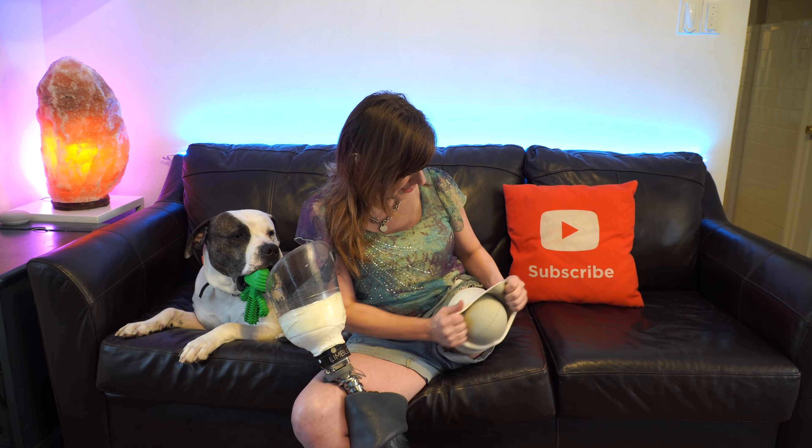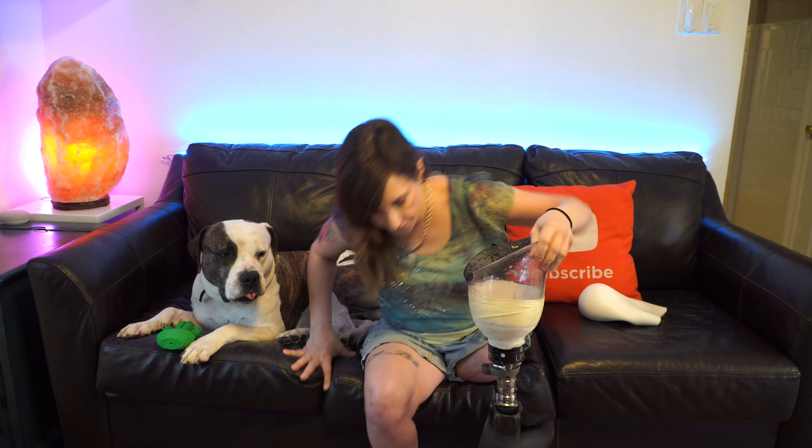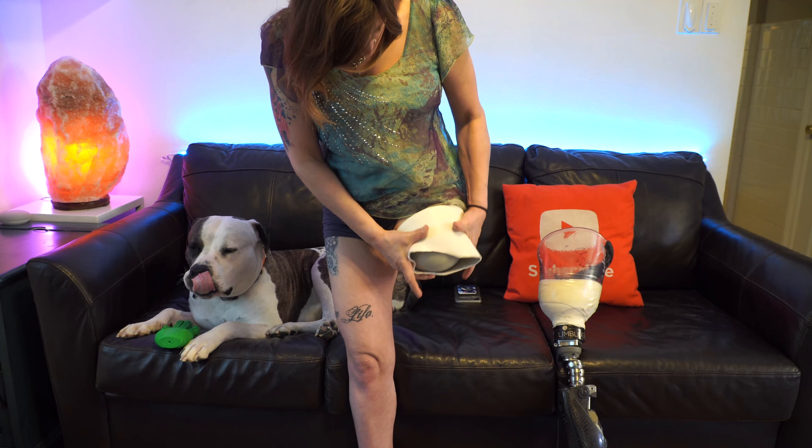As you can see, there's a sleeve over the entire check socket, and this is for the vacuum system. I'm gonna turn the vacuum system off, take the sleeve down, take my leg out — and there we have it, the check socket. This socket is made of a sort of thick plastic material and it is kind of fragile, so they have fiberglass material over this part to make it more secure between the distal connector — distal means further away — and the check socket.